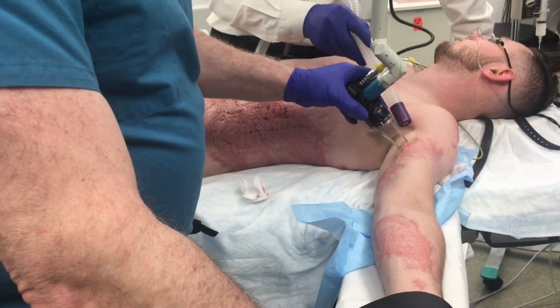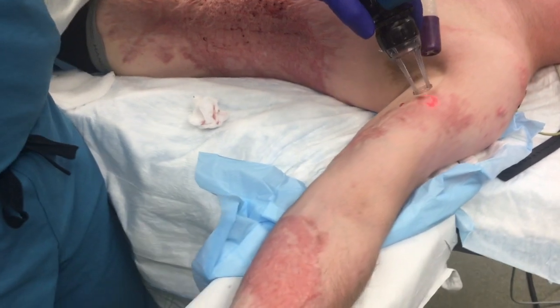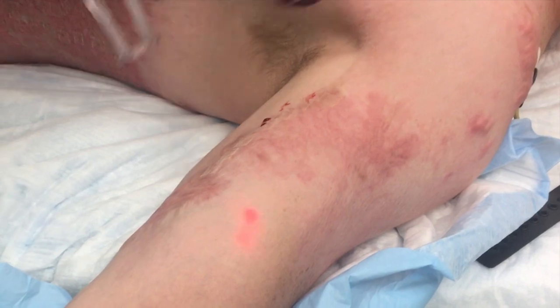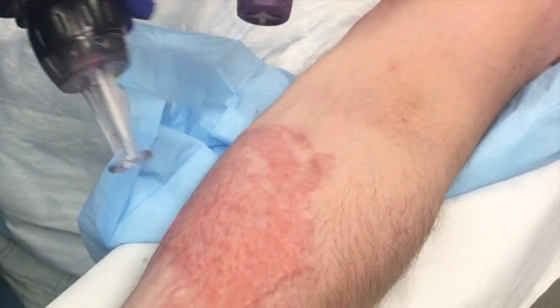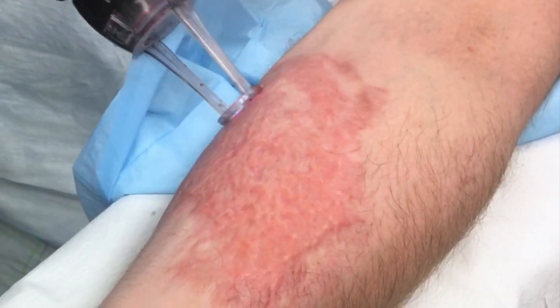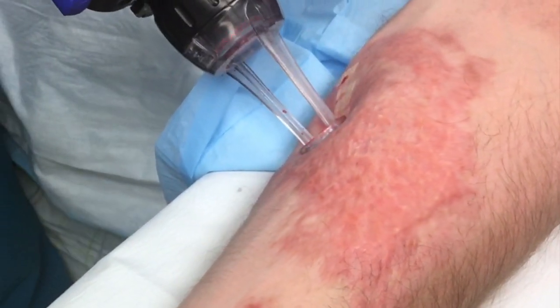Some of the burned areas that have healed secondarily can also form hypertrophic ridges, which we're treating with the deeper penetrating laser. And if you look down at the forearm, you'll see areas that have been skin grafted, designated by the cross-hatch pattern, that we'll be treating with the deeper penetrating, higher energy laser intervention.